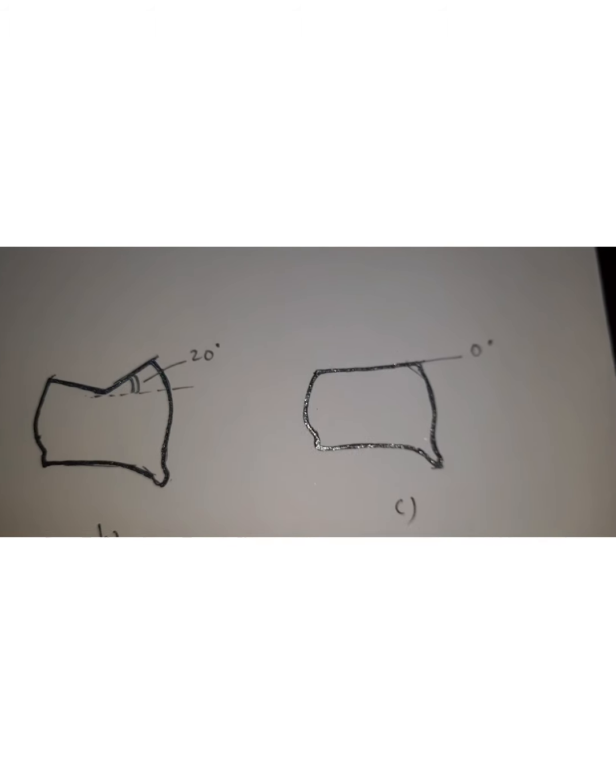Next, on the basis of the type of material, the denture teeth can also be classified. That is, they can be acrylic teeth or porcelain teeth. They can also have gold occlusals on the surface, or acrylic resins with amalgam stops, acrylic teeth with metal inserts, or they can be interpenetrating polymer network resin teeth, which is commonly called IPN resin teeth.